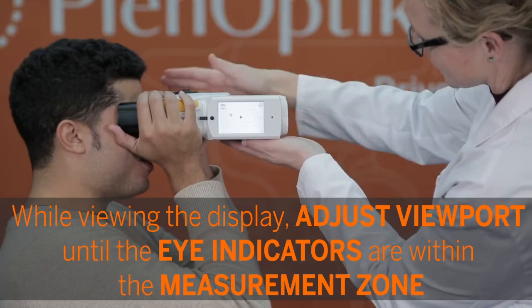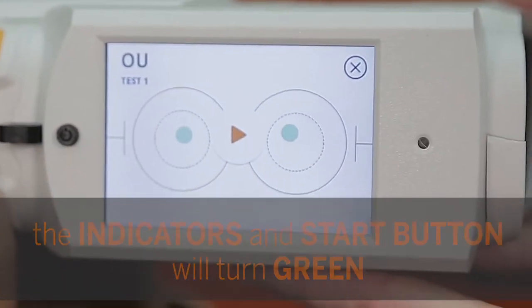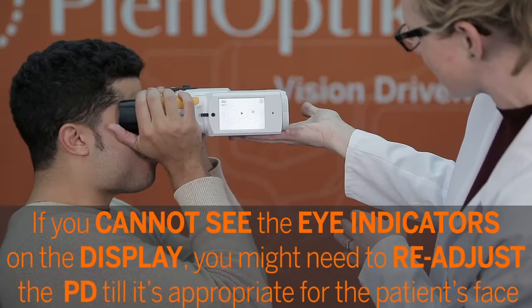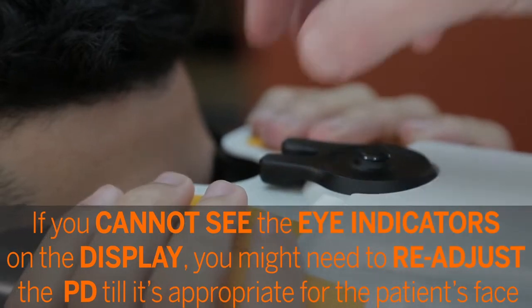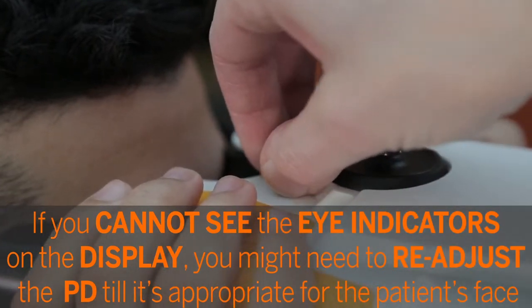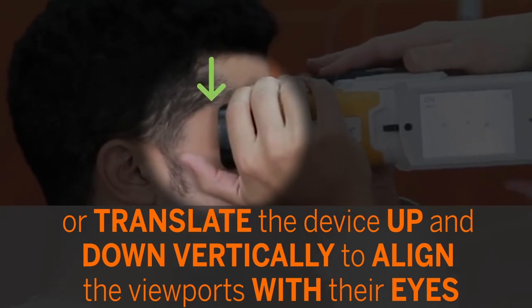While viewing the display, adjust the viewport until the eye indicators are within the measurement zone. The indicators and start button will turn green. If you cannot see the eye indicators on the display, you might need to readjust the PD until it's appropriate for the patient's face, or translate the device up and down vertically to align the viewports with their eyes.